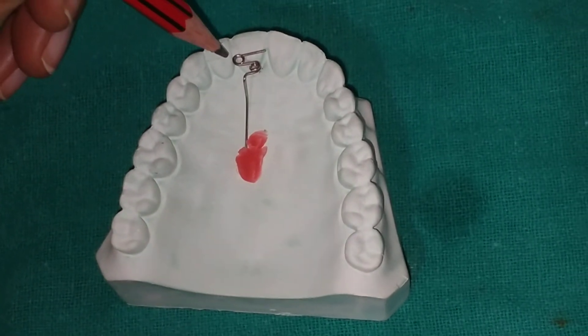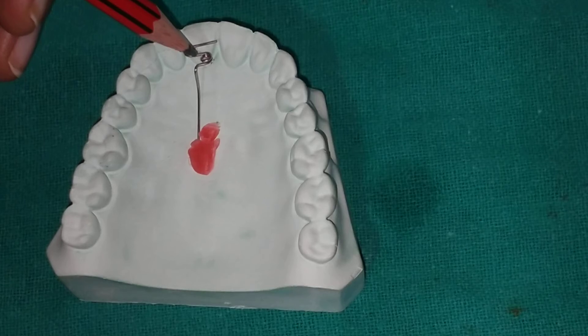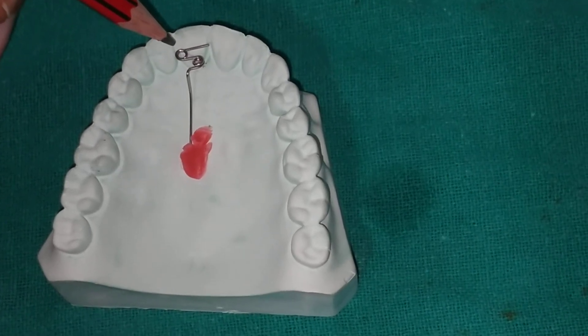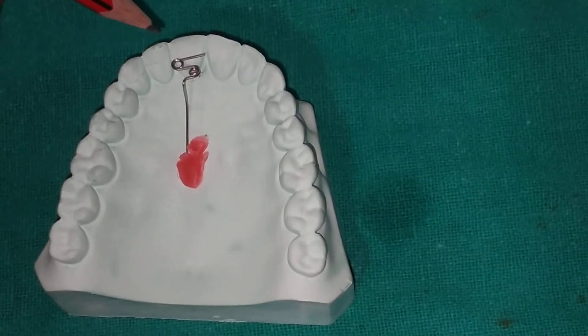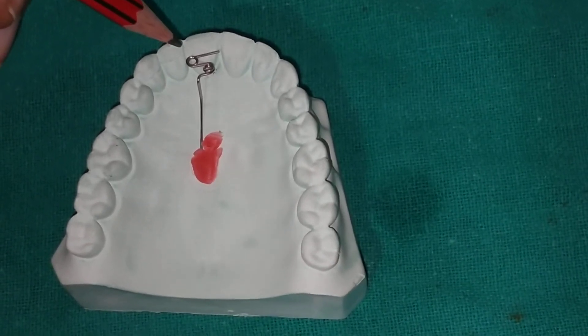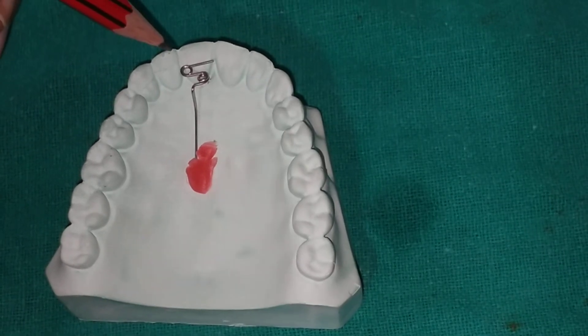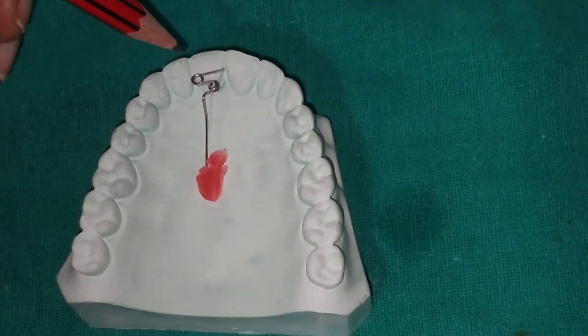The first helix is distal to the intended tooth movement and the second is mesial. The Z spring is used for labial movement of a tooth which is in cross bite. It can also be used for mildly rotated or tilted teeth.